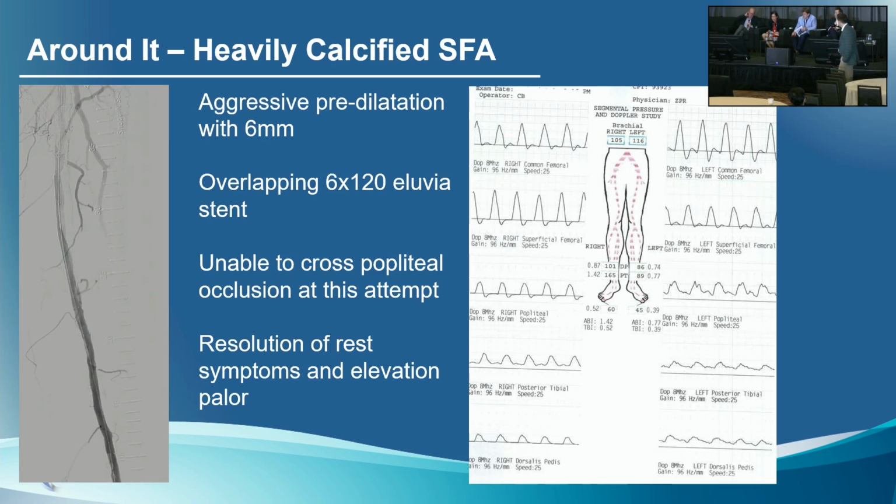Zach, I was just going to ask you if you imaged or considered doing any kind of intravascular imaging before you stented after you recanalized. We had the Pioneer device in, so we had the ultrasound there for vessel size, but we were subintimal. We knew that, and we had decent balloon expansion at that point in time.